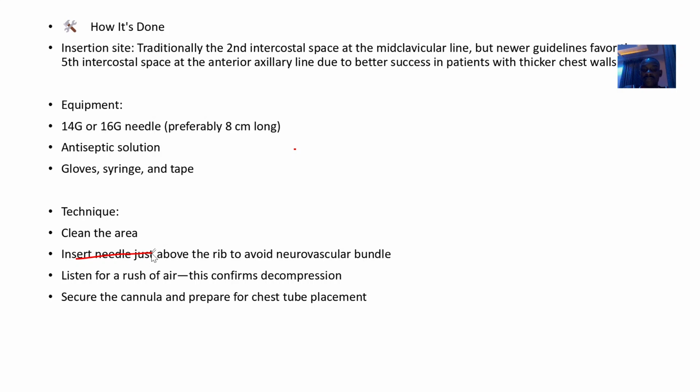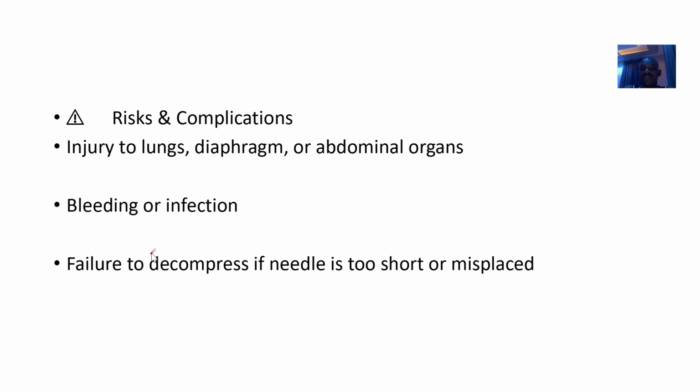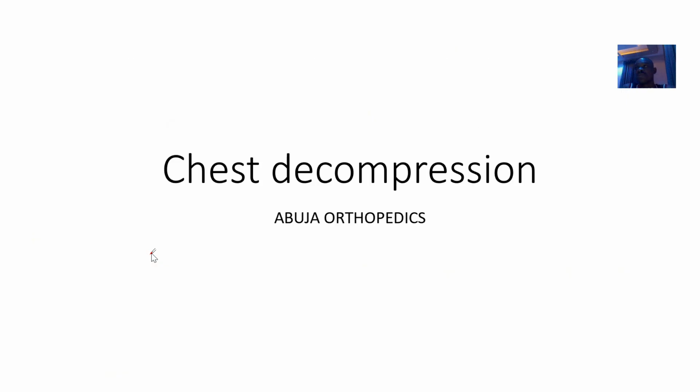You understand? So this is just how it is. Risks and complications: it could cause injuries to the lungs if it is not done carefully, right? Or injuries to the diaphragm or injuries to abdominal organs. Sometimes bleeding and infection, or sometimes failure to decompress. That's if your needle is short. You understand? So that's just what this chest decompression method in handling emergencies simply entails.